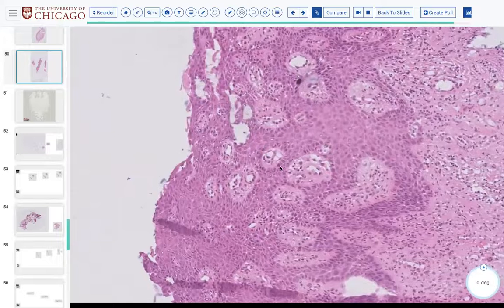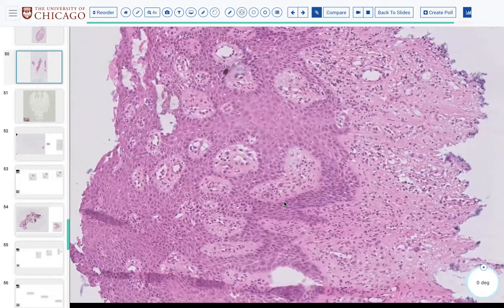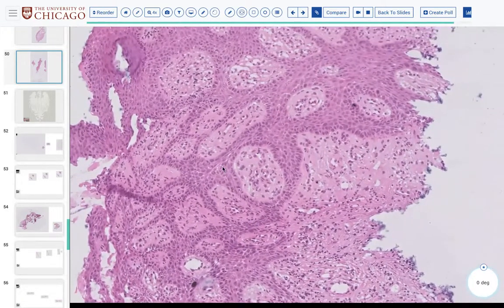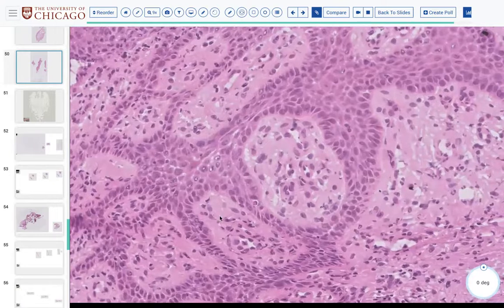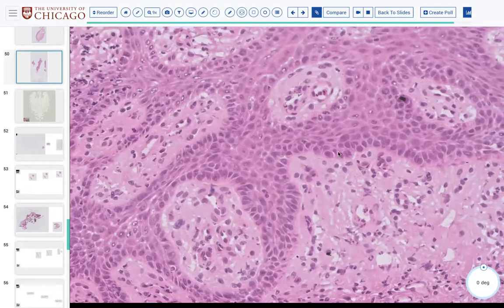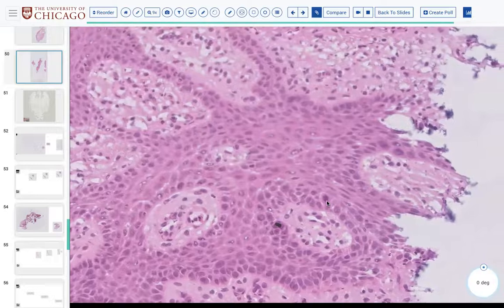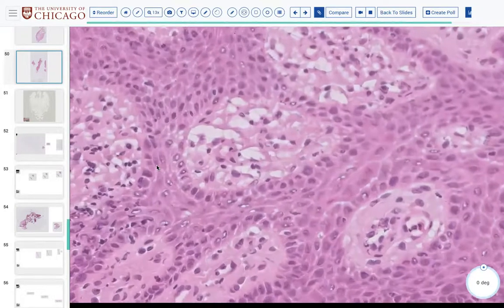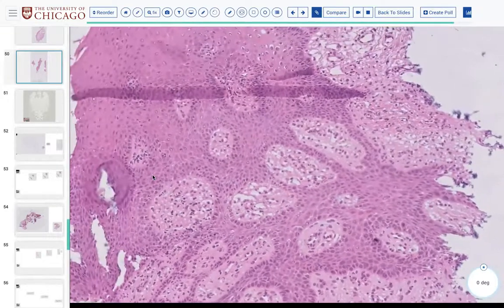Yeah, this to me honestly is a bit challenging just because of the very poor orientation. Once you see this almost network-like cut pattern, where you have these reedy bits poking up, that means it's tangentially sectioned, so this tissue is not well oriented. But even in the places that it's not well oriented, I agree. There's definitely a lot of disorganization, some potato-y larger nuclei, some dyskeratotic eosinophilic cells. So this might be one where you definitely might want to get deepers, or at least as you guys are expressing some concern about, maybe this is not nothing.